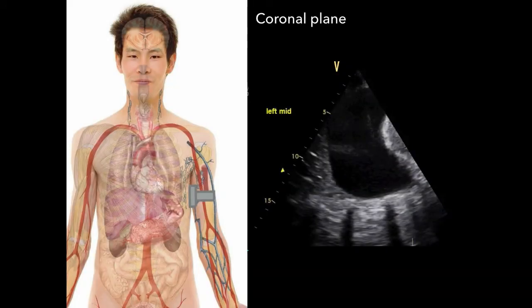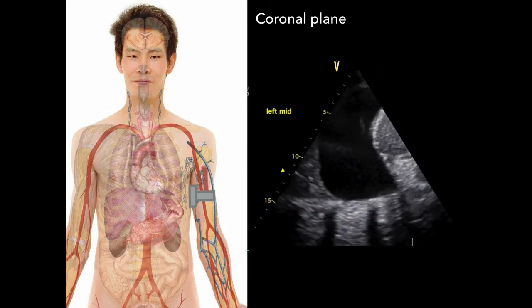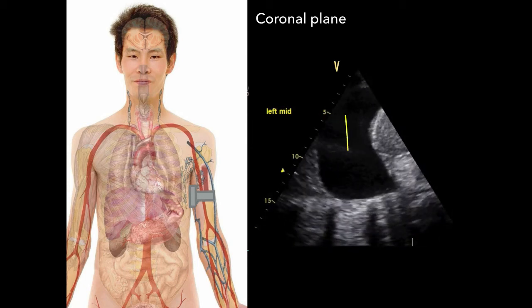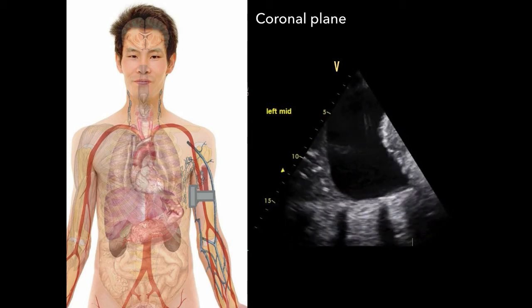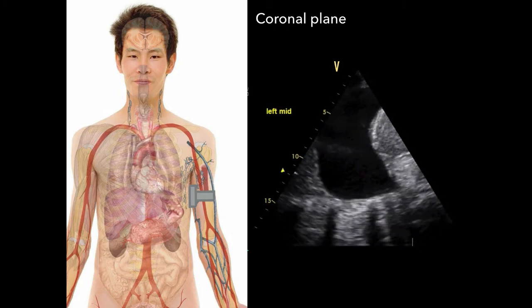This is an image collected from a patient, the left mid-axillary line. We can see a large anechoic space with the clear margins of the diaphragm. We see the spine, again, with an acoustic window with fluid. We see the base of the lung and the chest wall. We see that our marker is screen left.